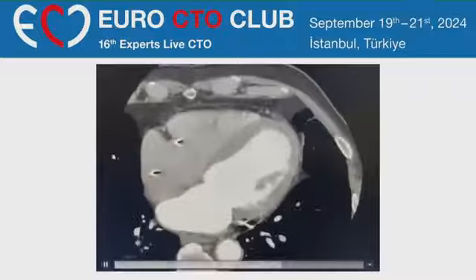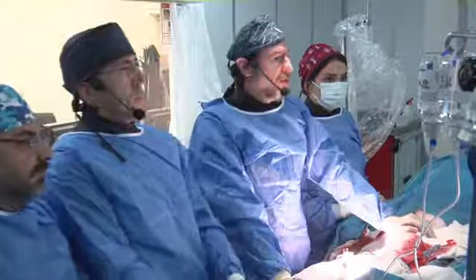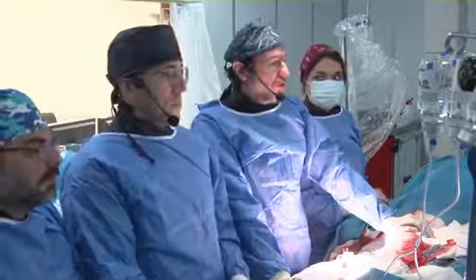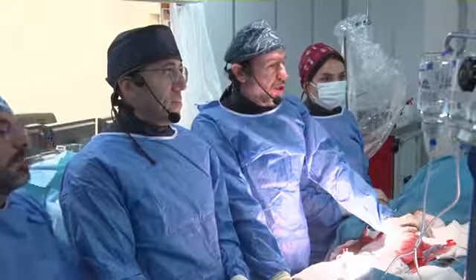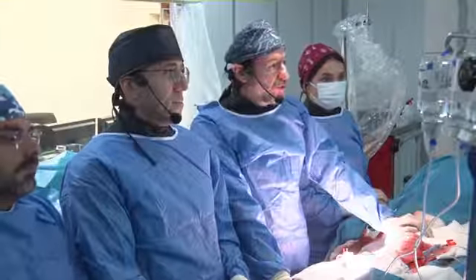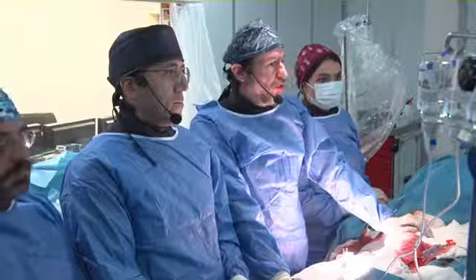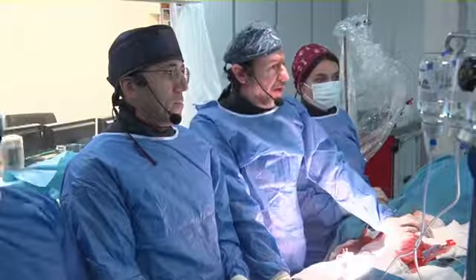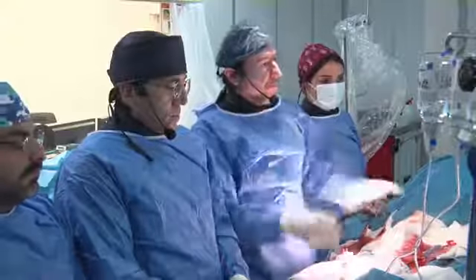Guys, can you hear me? So the problem with this case is, this is an ostial CTO. I hate ostial CTOs because you need antegrade vessel preparation, and without antegrade vessel preparation, your chance is only like tossing a coin into the air and hoping that you have the right answer. So therefore, I need your guidance here.